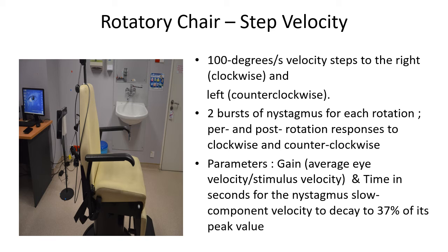The entire procedure is repeated with the initial rotation in the opposite direction, clockwise and anti-clockwise. Then for both sections, the computer will automatically carry out the data analysis, which is it will calculate the gain and the time constant.